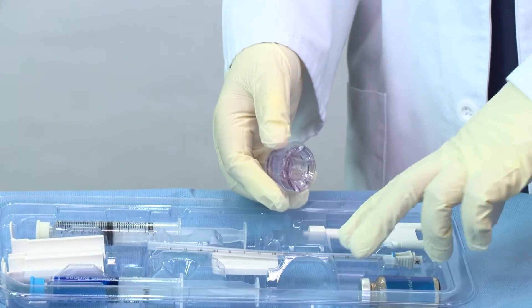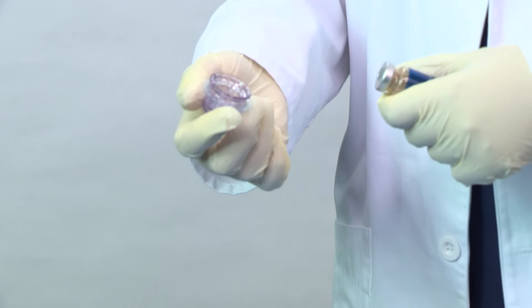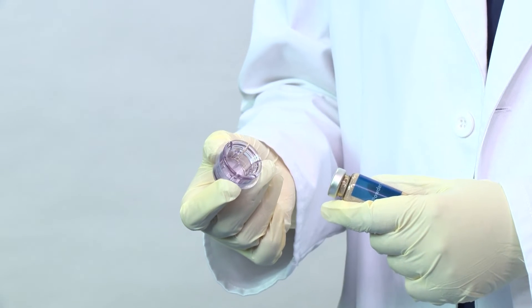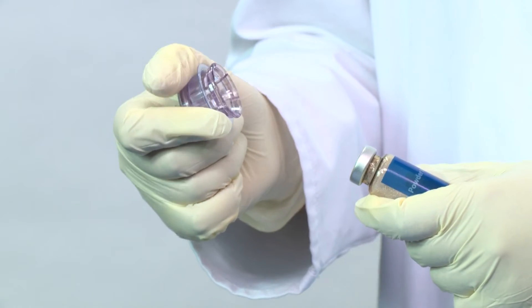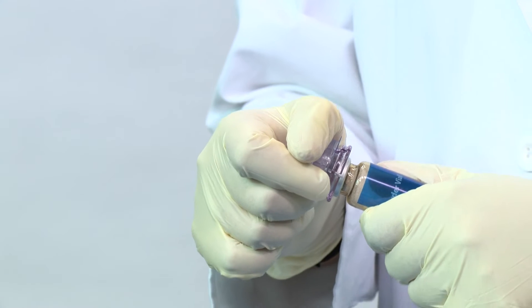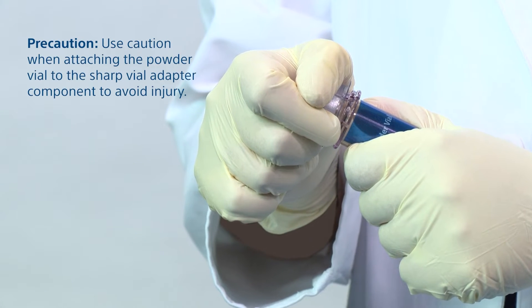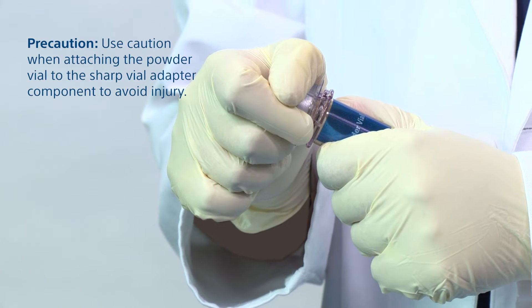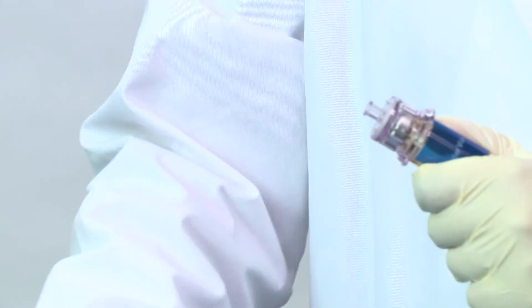Using sterile technique, with one hand pick up the vial. With the other hand, pick up the packaging cup that holds the vial adapter. Do not remove the vial adapter from the packaging cup. Attach the vial adapter in the cup to the vial by pushing together until fully seated. Use caution when attaching the powder vial to the sharp vial adapter component to avoid injury. Remove the cup from the vial assembly and discard.